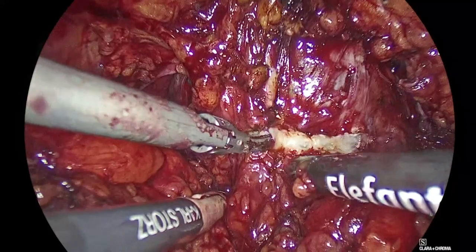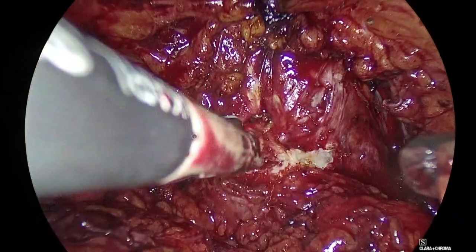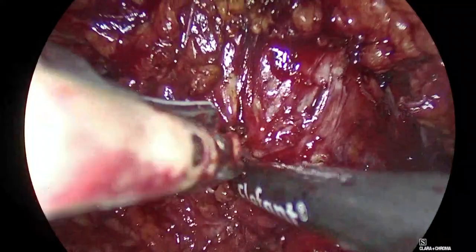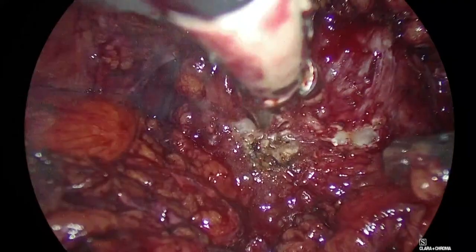Tommy, come closer, Padeli. Good. At this point now, this is a crucial move. Come closer. No. A little bit more. Good. As I said, good hemostasis is very important.